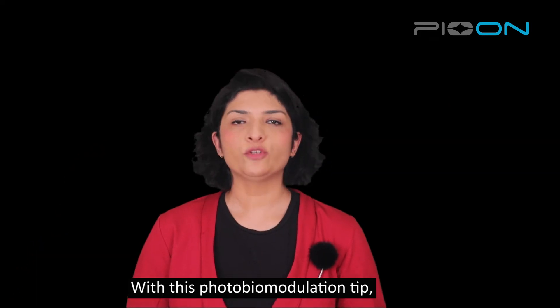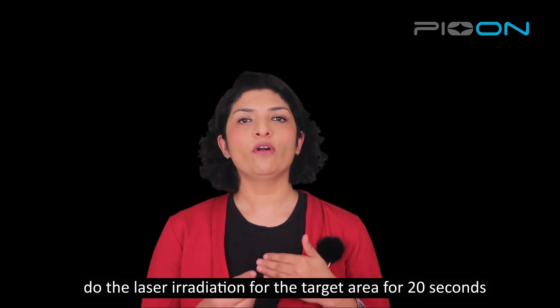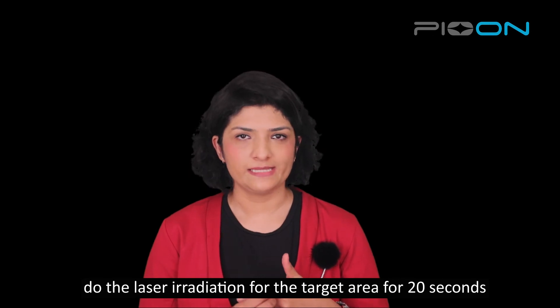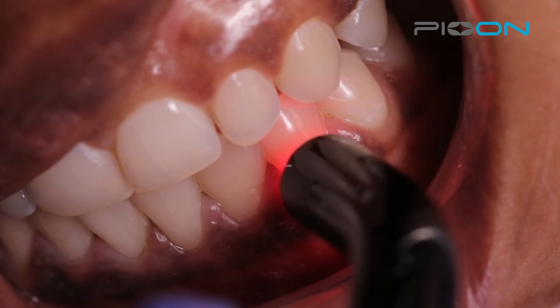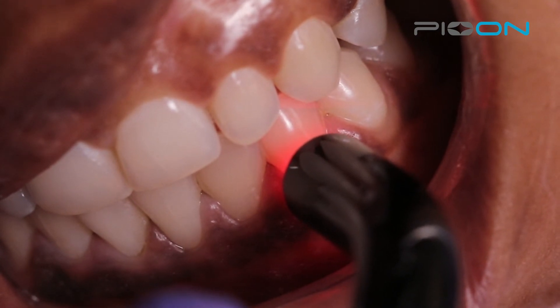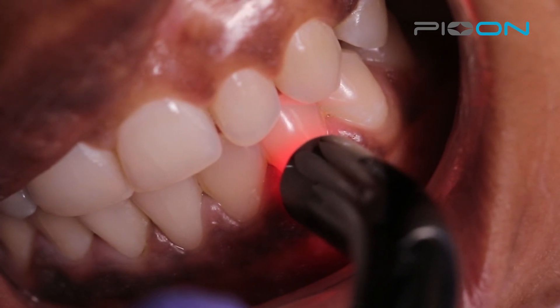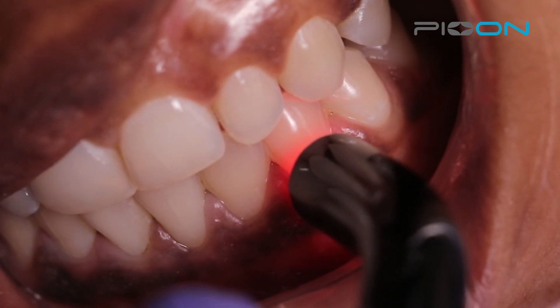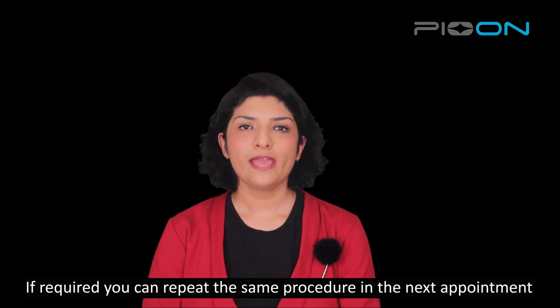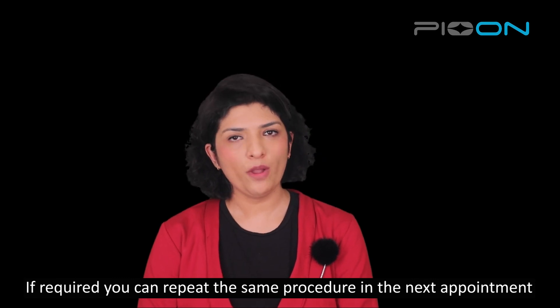With this photobiomodulation tip, do the laser irradiation for the target tissues for 20 seconds. If required, you can repeat the same procedure in the next appointment.